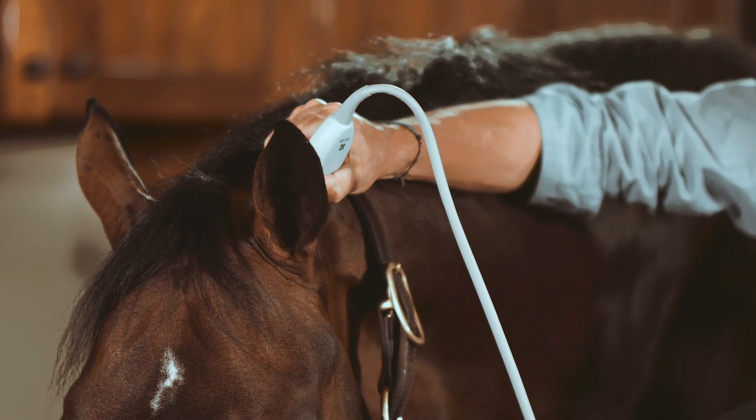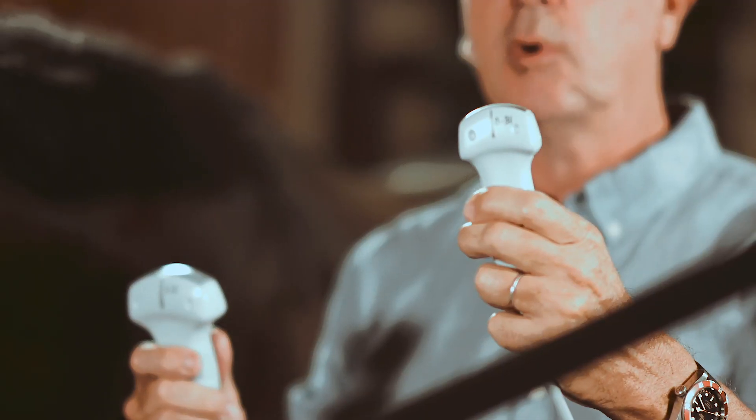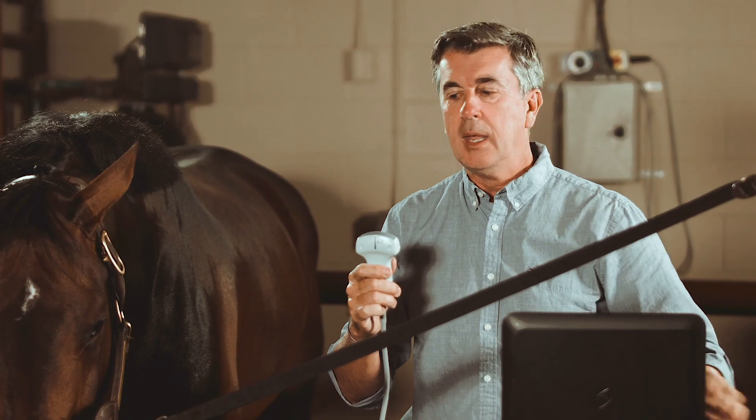On this machine we have a choice between a 2 to 5 MHz wide convex probe or a mini convex probe at 3 to 8 MHz, which can be very nice. We are going to move on with this probe first.